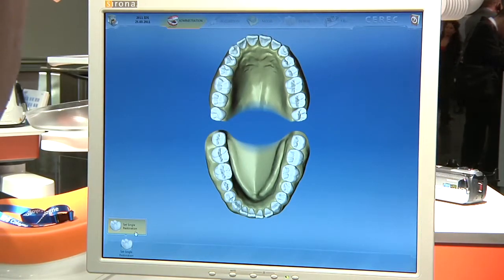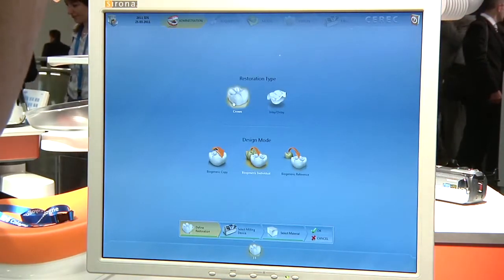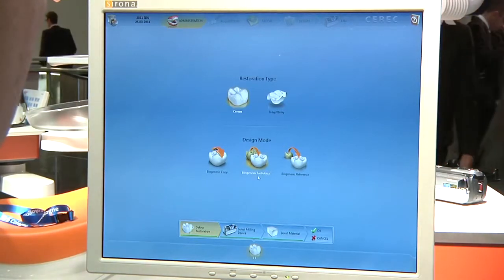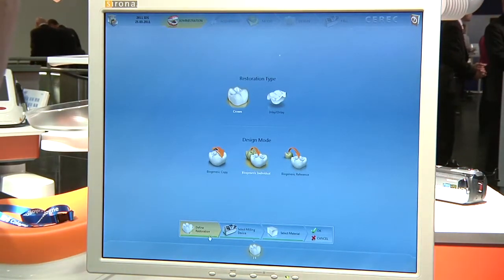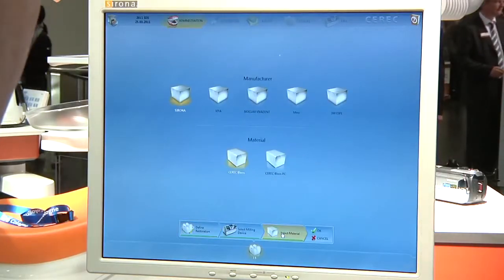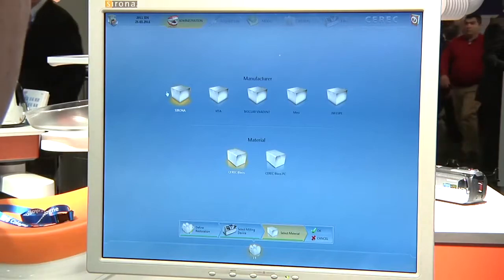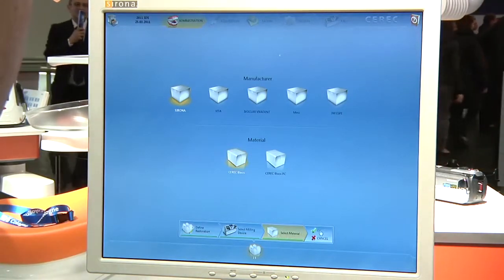We're set for a single restoration here this morning. We're going to do tooth number 19. Click on that — it gives us a tooth, and right away we're going to the restoration type: crown or an inlay and onlay, and then design mode. We're going to pick crown. We're going to use the biogeneric individual. Whenever anything is in green, we can move on. One of the changes we're going to like is that we actually pick our material at the beginning rather than at the end in mill preview like previous softwares. So we select the different types of blocks and the material in that block. We already have our material, our milling chamber, and we've defined our restoration, so now we can hit OK and move on.